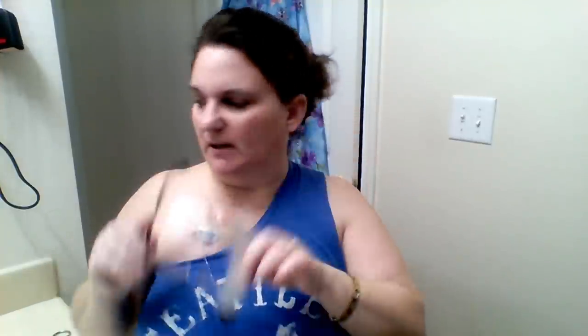This other half I use to reinforce my port, and the reason I reinforce it is because sometimes when I'm in bed or on the couch and I'm hooked up to my port, I might swiftly move or think I have more cord than I thought, and it pulls on this — and when it pulls, it's pulling on my port needle. I could do some damage. In the past when I had home health, I did do that — I got it caught on a cabinet in my kitchen and it hurt like a beast. So I really try not to do that here at home.